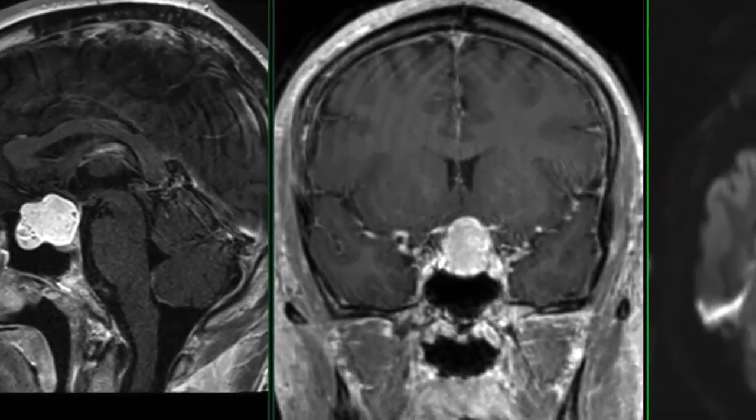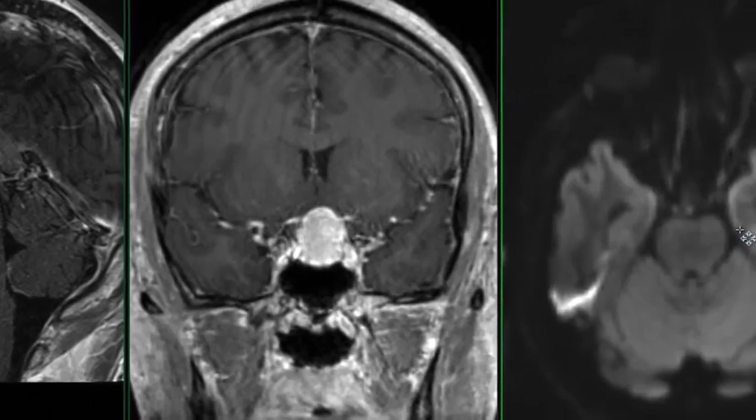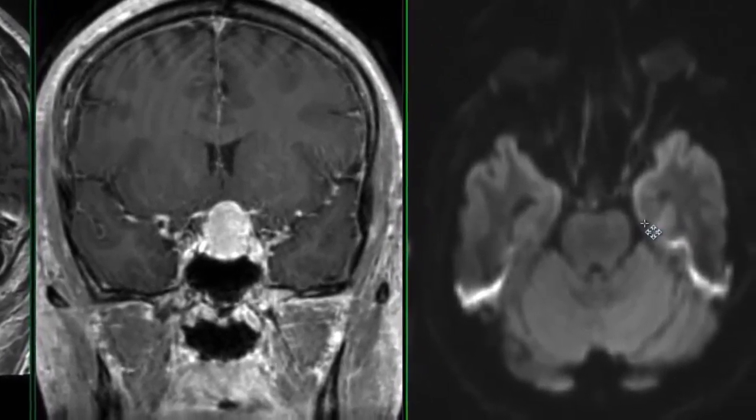Diffusion-weighted imaging, as seen here, demonstrates no evidence of restriction, which also supports the idea of a dermoid cyst over an epidermoid. The midline location and all of these imaging features are highly suggestive of a dermoid cyst.